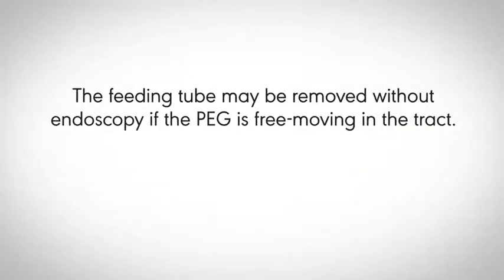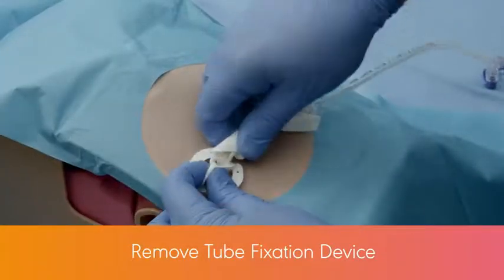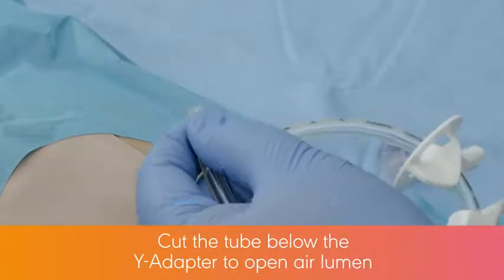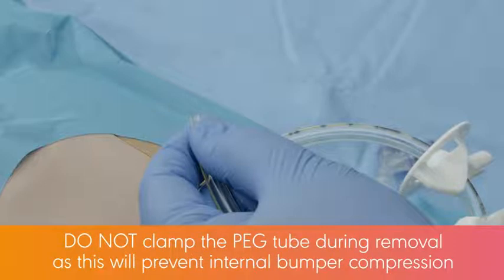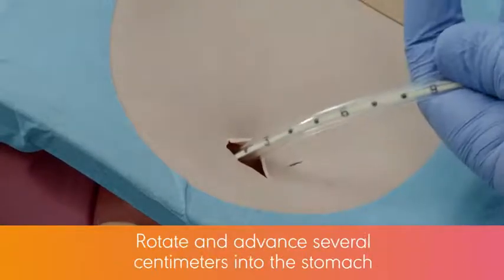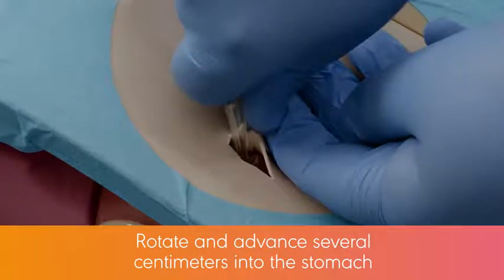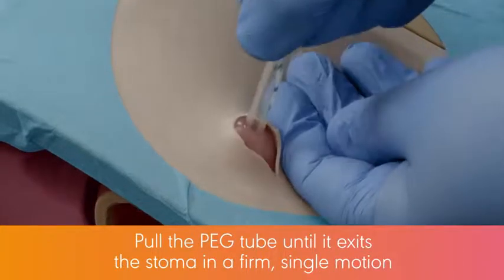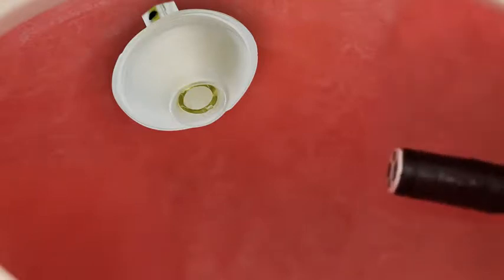The feeding tube may be removed without endoscopy if the PEG is free moving in the tract. Sedate the patient if required. Remove the tube fixation device cover from the base and slide both away from the abdomen. Cut the tube below the Y adapter to open the air lumen. Note: if a jejunal tube is in place, remove it prior to cutting the PEG tube. Do not clamp the PEG tube during removal, as this will prevent internal bumper compression. Lubricate the PEG tube and skin around the stoma. Rotate and advance the tube several cm into the stomach to disengage it from the stoma and lubricate the tract. Support the abdomen around the stoma with your hand, apply gentle downward pressure, and pull the PEG tube until it exits the stoma in a firm single motion. If the tube cannot be removed with a reasonable amount of traction, it should be removed by endoscopic retrieval.